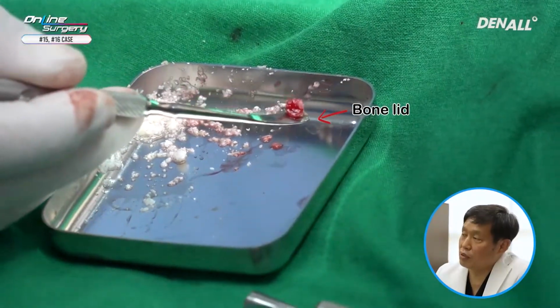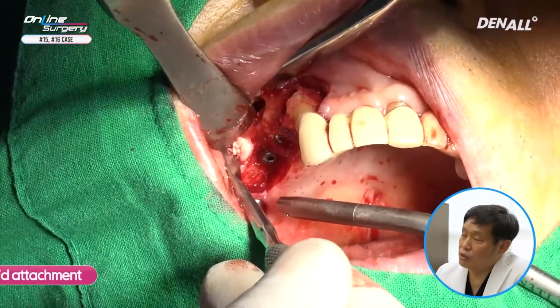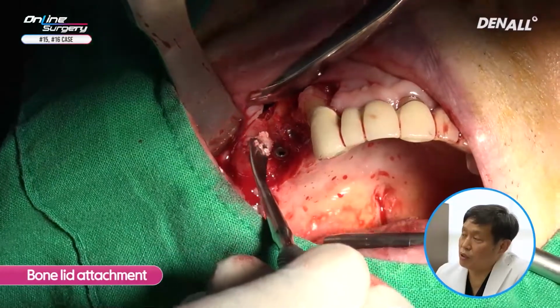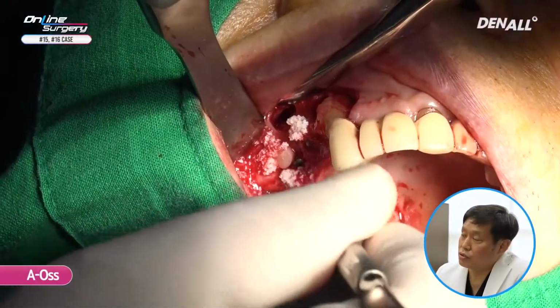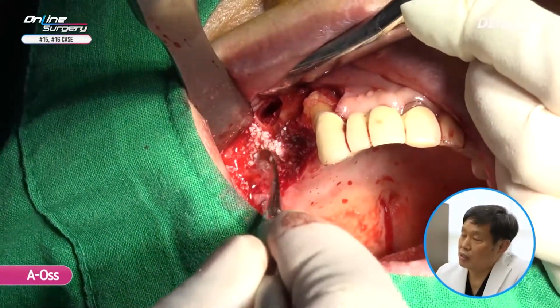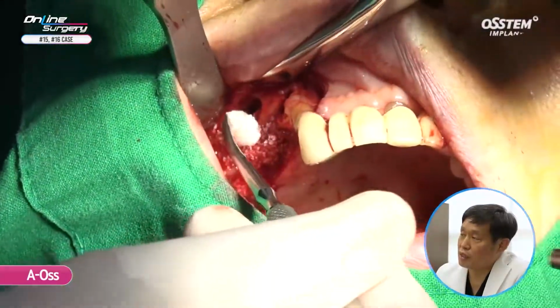You can see the bone lid that was formed during the bony window. On the buccal side of number 16, because there's a buccal defect, it's going to be used like an autogenous bone block, and on top I'm adding more AOS for bone graft.